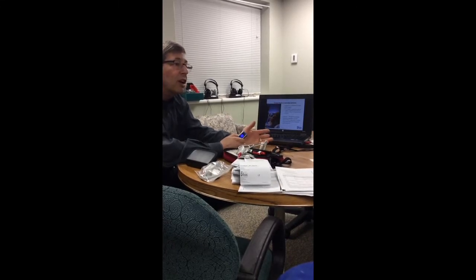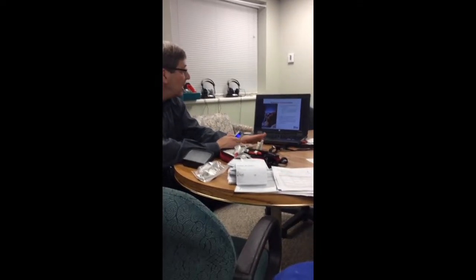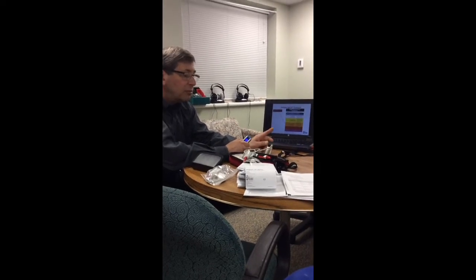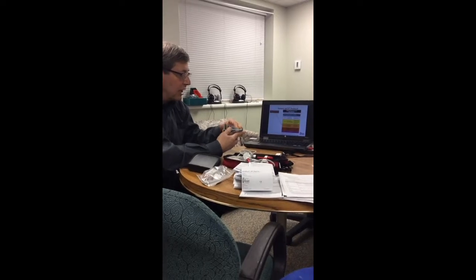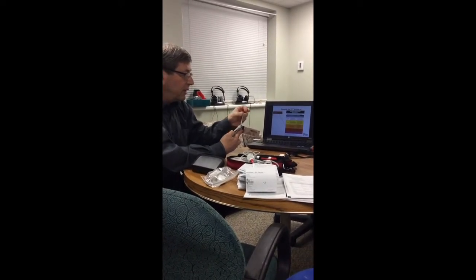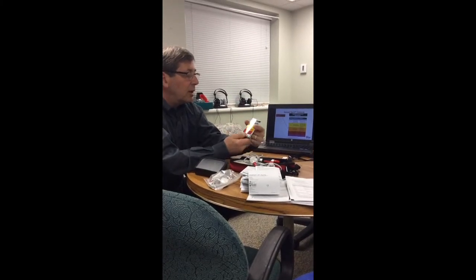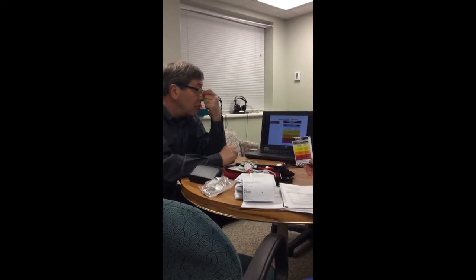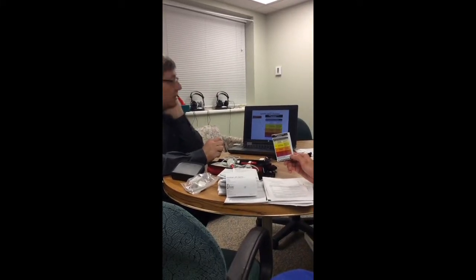So your treatment considerations: 100% oxygen. Got to know high flow oxygen is absolutely positively great. Now you have an SpO2 SpCO assessment guide, and we're going to open it to that, and we're going to keep that in there. I don't expect people to have to open this up to figure out the device. So you're going to look at this chart. The chart pretty much shows you what the exposures mean, and it really isn't until we get into the 10+% that we need to be concerned.